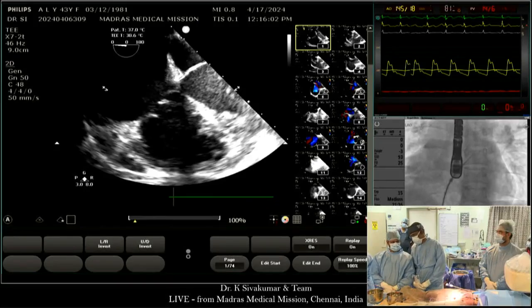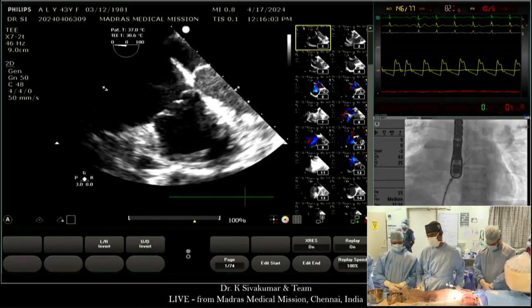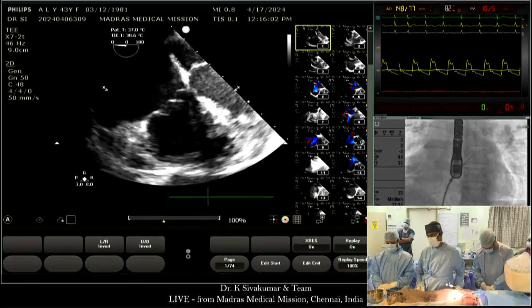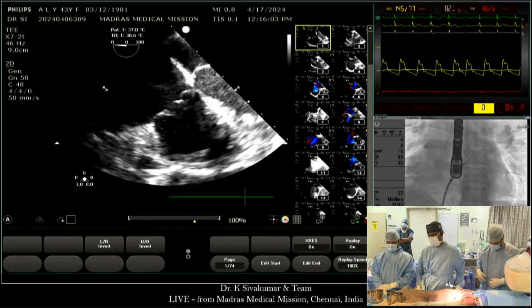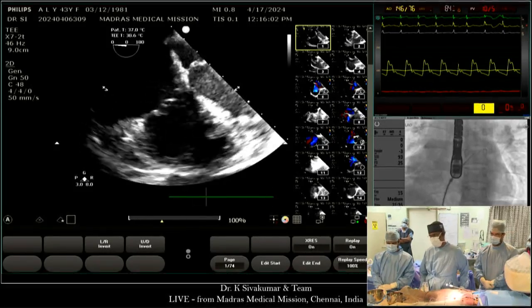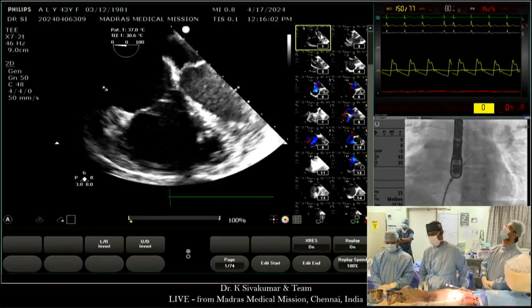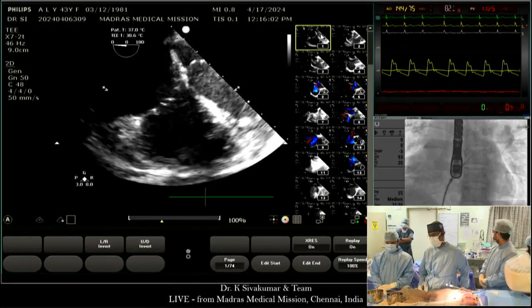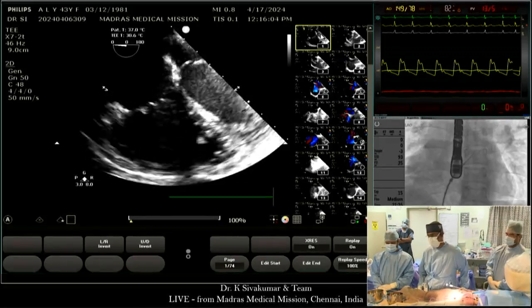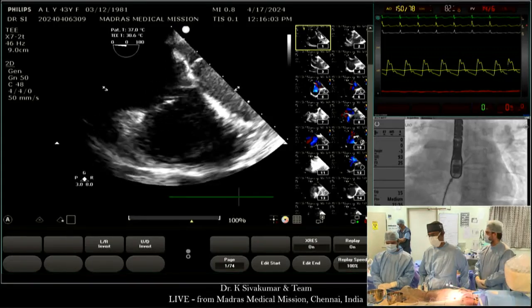At the surgery, we will connect that vein to the left atrium. We will do the tunnel in the superior vena cava. Also, we are enlarging the superior vena cava with another patch. If I see a pulmonary vein that is going to the right side, I usually, most of the time, do the same thing. And the patching material for ASD is usually fresh autologous pericardium, which generally does not calcify and will not generally cause future problems in terms of stenosis or obstruction. So the chances of obstructing the vein are minimal.